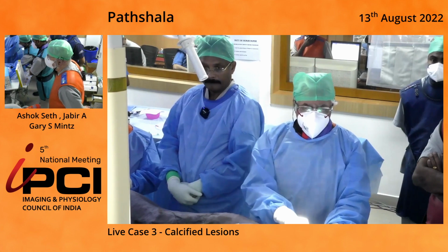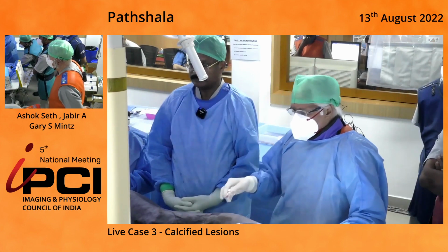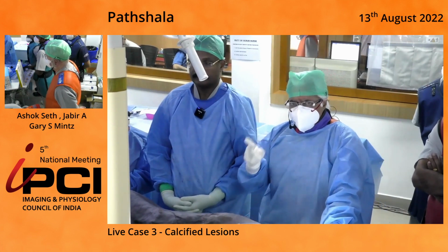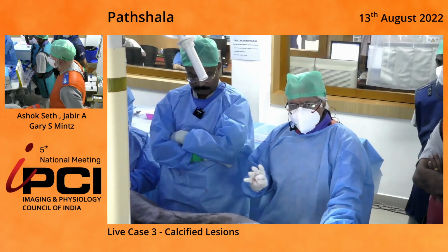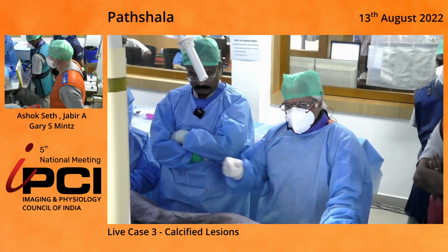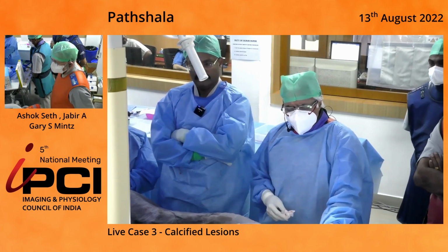My next question to Gary, okay, our strategy is going to be clear. We have circumferential calcification outside 2 layers of stent. We have thick calcium. We know the tool to use is Shockwave. That's very clear, IVL. And I'm absolutely clear in my mind that after IVL, we would need to go to the best form of non-compliant balloon.